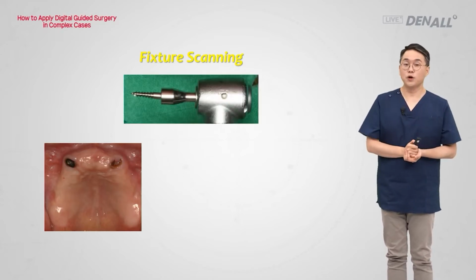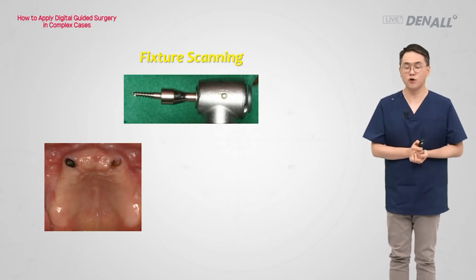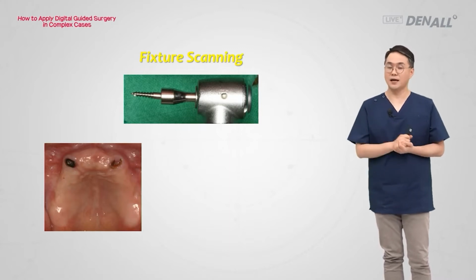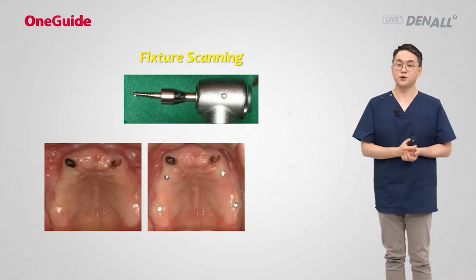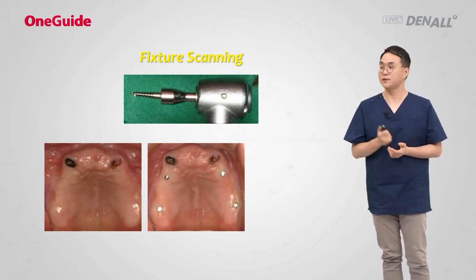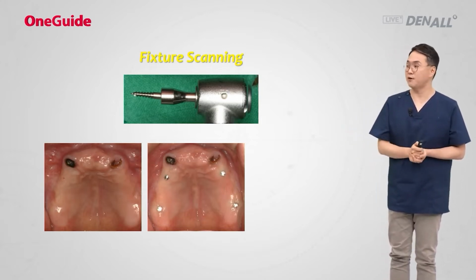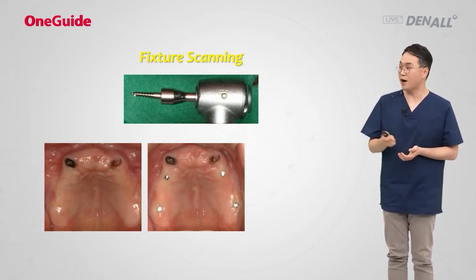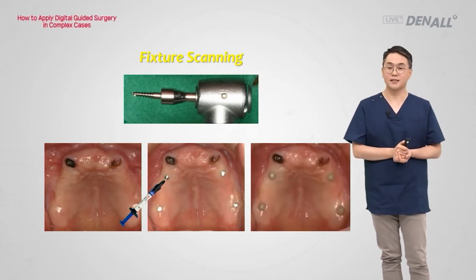First, in this patient, Osstem ortho screws are used. Ortho screws of 1.6 mm diameter and 4 to 6 mm length are placed. Anesthesia needs to be used, so it is a little invasive, which is a disadvantage, but it can most definitely fixate the radio-opaque markers. 3 or 4 ortho screws are placed without additional drilling. As it has a sharp apex, it can be easily inserted on top of the placed ortho screws, where wires will be connected. Radio-opaque markers are attached with a flowable resin.